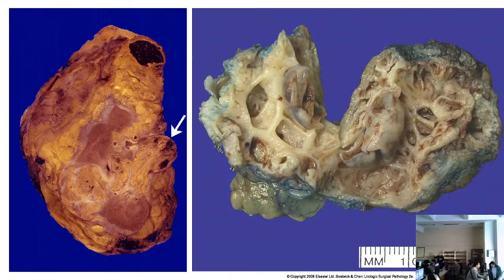So, as ascending all these thrombus, which veins have been occluded? The ones taking the blood from the adrenal gland. So, what infarct is this one, which is as a complication of the tumor spread?